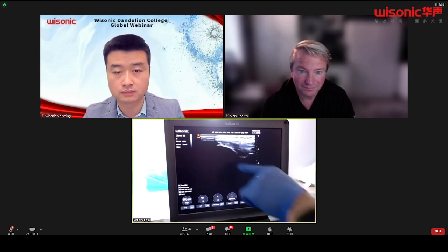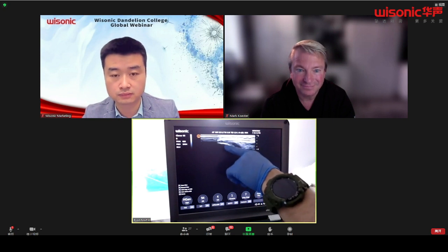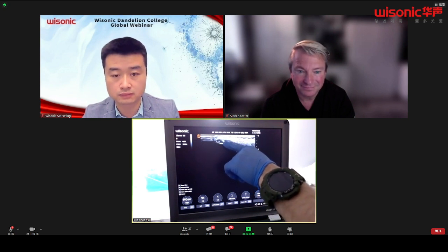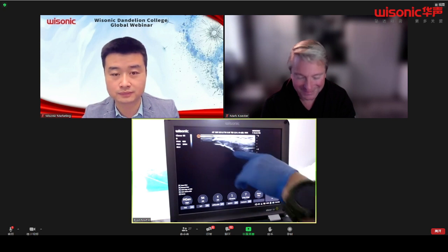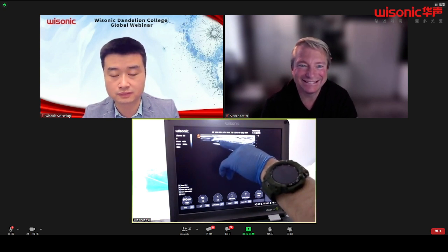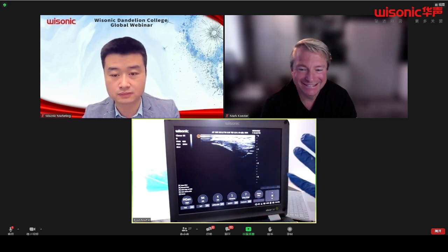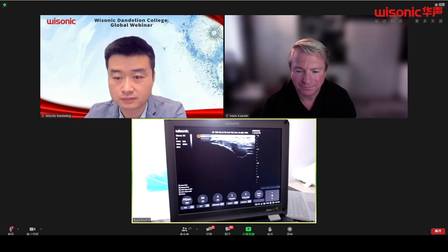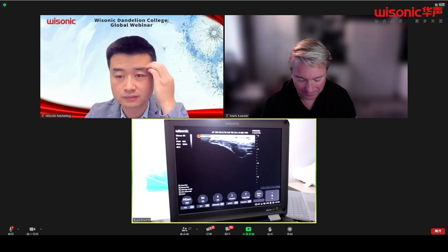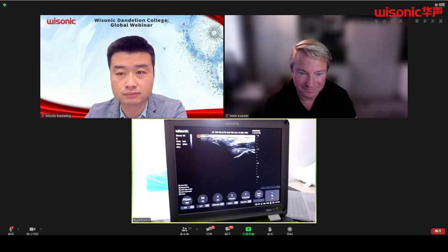I would also ask if he had some issues with the common flexor. I see something going on up at that distal enthesis here, right up on the top here. So anyway, Tim and I will have a long talk afterward probably, but what you're all seeing is some enthesophytic ridges or bone spurs on the distal end here. And it looks like heterogeneous, right? Remember that thickening. So this would fall into the category of a tendinopathy with a possible injury to the UCL at one point in time. Okay, and he is shaking his head. Yes, that is true.